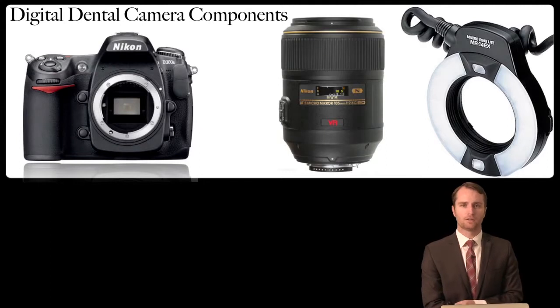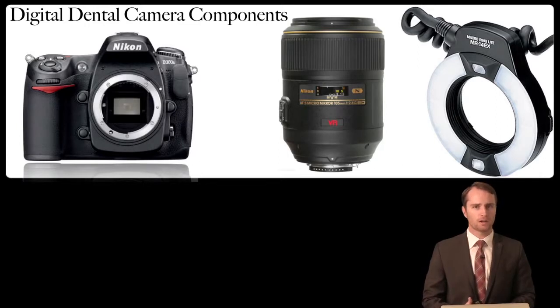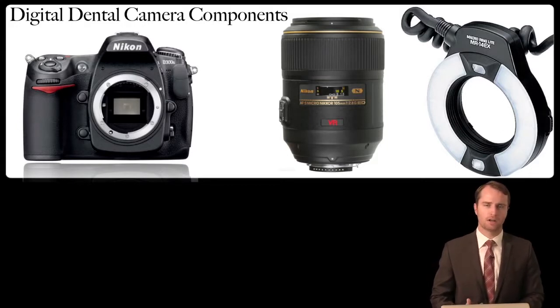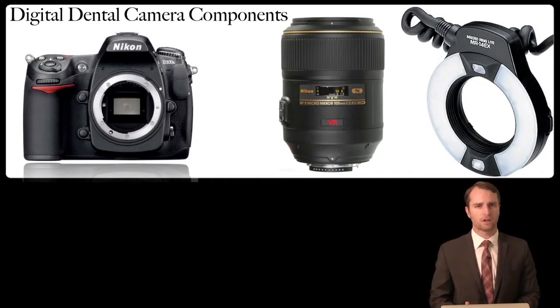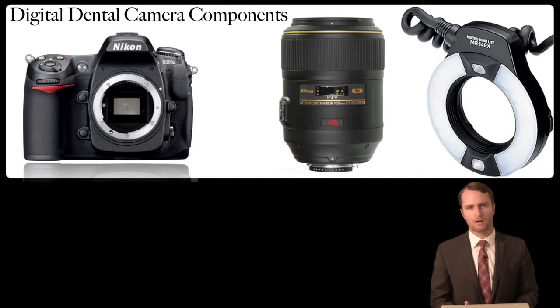It can be a little daunting at first when coming into dental photography and deciding what equipment to select. I know there are a lot of different camera types out there. It's changing all the time. There's a lot of different components to this. We'll talk about creating a camera system for your practice that is highly effective in terms of both being easy to use but also producing very high quality images. When implementing the things that we talk about, after the settings in the camera are performed, typically it's a point-and-shoot matter for our clinical photography.